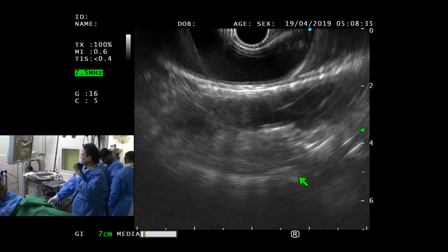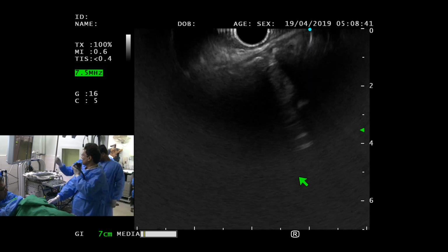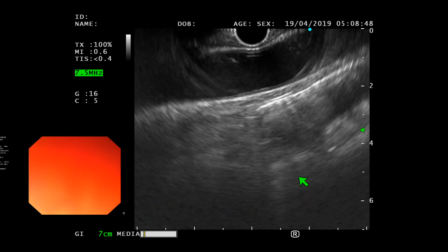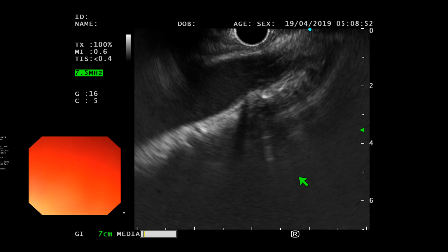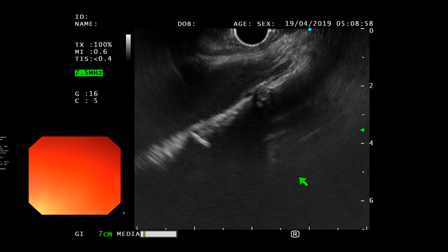Okay, so you're at the aorta now. We're quite happy that we reached the aorta. No, the aorta is still to the clockwise. There it is. Okay, now what do you think you need to do next? Okay, push. All you do is slide push. Beautiful image. Your left hand did not move at all, right? Why not? We just discussed that it has to move, right?